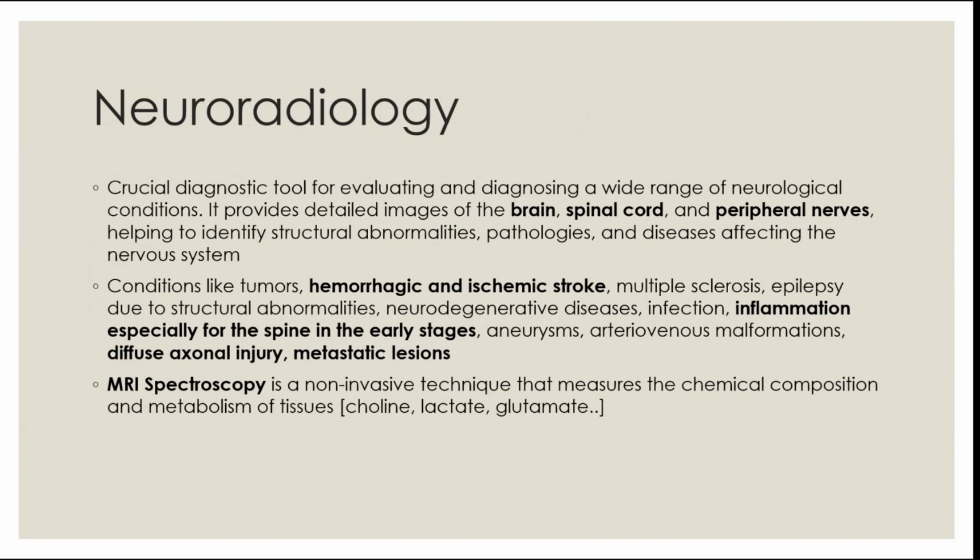Neuroradiology is the most important, the area where MRI is really used. You can start with a CT, and if CT findings were inconclusive, you can do an MRI. So you can evaluate the brain, the spinal cord, the peripheral nerves.